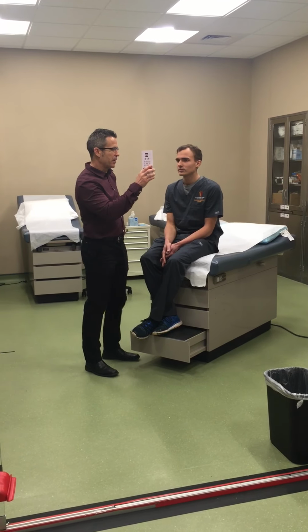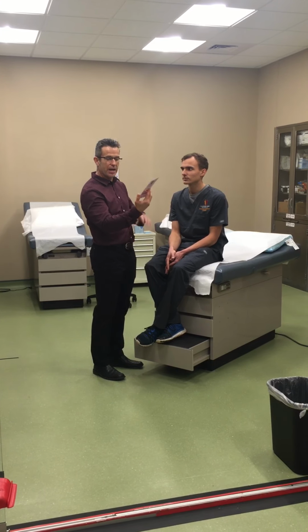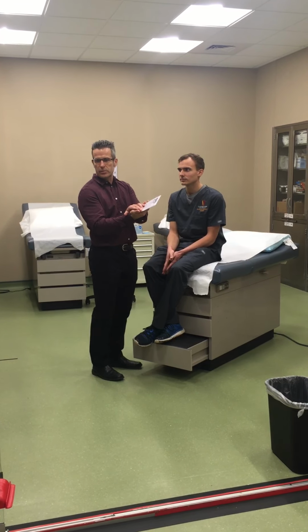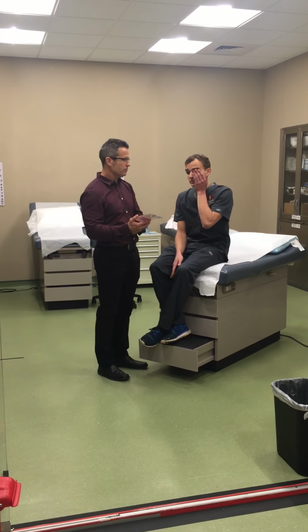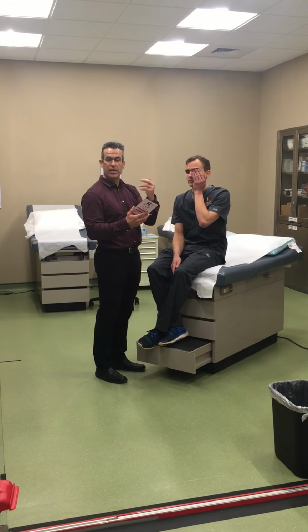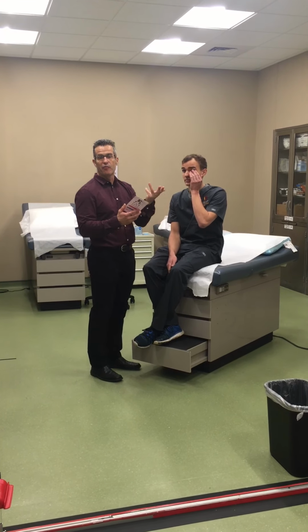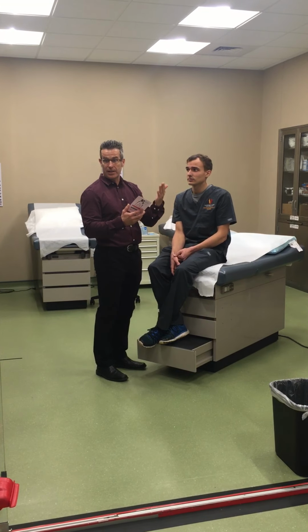I have students all the time that are like, good job. All right, read the next line, cover your other eye. You've got to know what he's reading so you can give him a measurement. So he was 20/20. So now I would ask him to cover the other eye. Now this time I'm going to change it. I asked him to read left to right so that he doesn't just say what he remembers from what he just read. Now we'll ask him to read right to left.